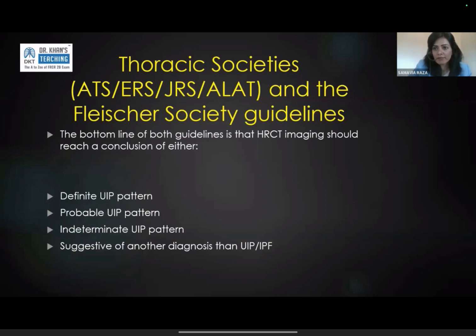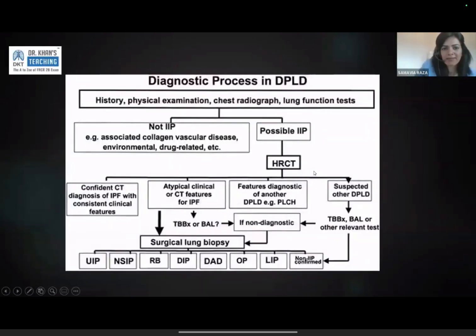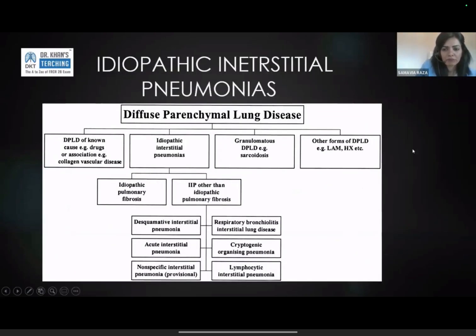Can ILD be unilateral? It can be. ILD can have all sorts of weird presentations, and it can be asymmetrical quite commonly. It can very rarely be unilateral as well. And then the question comes in: is that primary ILD, or did that patient just have an infection on that side of the lung, or a hemorrhage on that side of the lung, that they ended up with a scarred lung that looked like ILD? So that's a discussion of what's happening, but technically yes, they can.